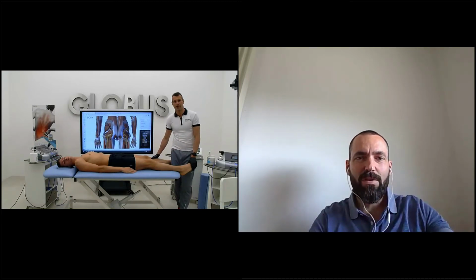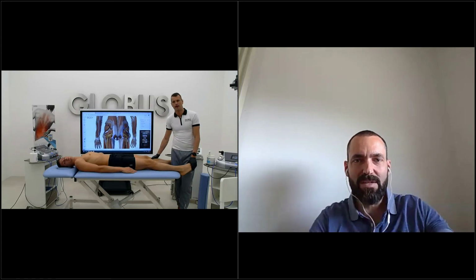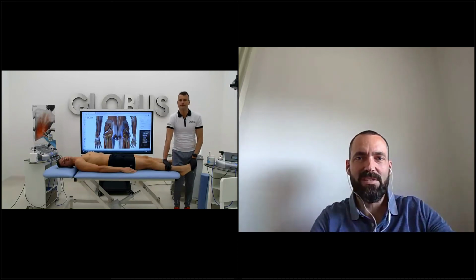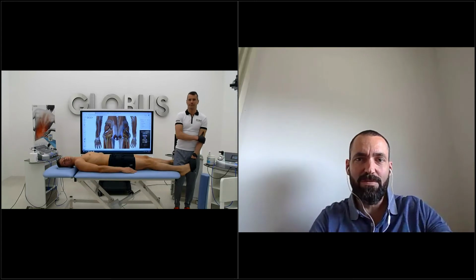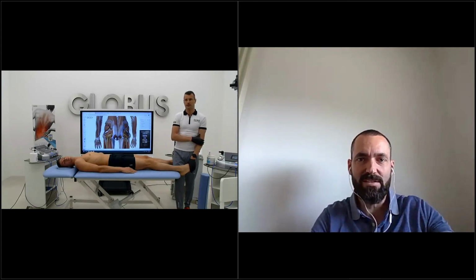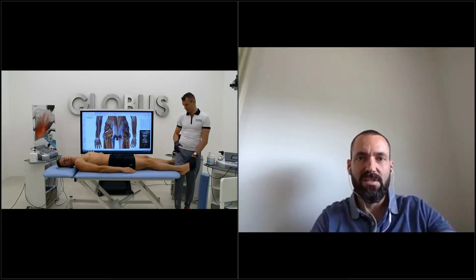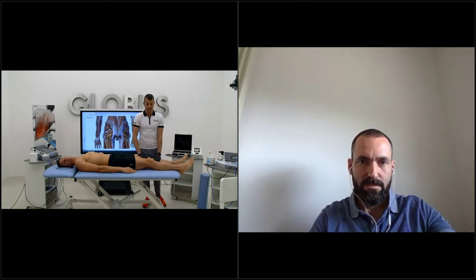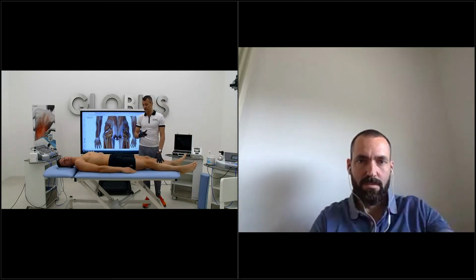And as you told before, when you find that you need to treat more the sacral part of the piriformis, I think this position, lying on the front, is the best way. When you have to treat more the tendons or the femoral part, you lie on the lateral side, and you can go with a small bend of the hip and the knees. You can go deeper. It's a good way. And why not make both? Exactly, exactly. So let's do what you suggest.